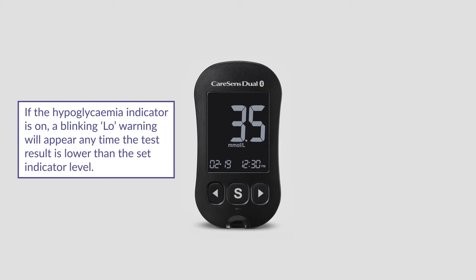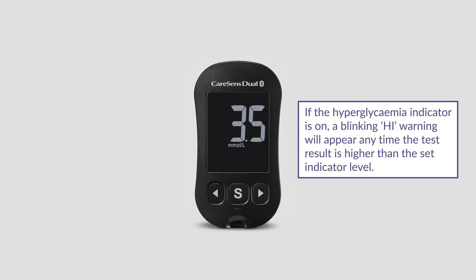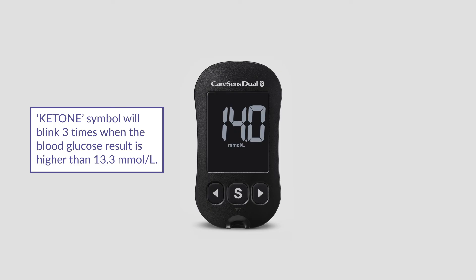If the hypoglycemia indicator is on, a blinking low warning will appear in the bottom left corner any time the test result is lower than the set indicator level. If the hyperglycemia indicator is on, a blinking high warning will appear in the bottom right corner any time the test result is higher than the set indicator level. The ketone symbol will blink three times when the blood glucose result is higher than 13.3 millimole per litre.